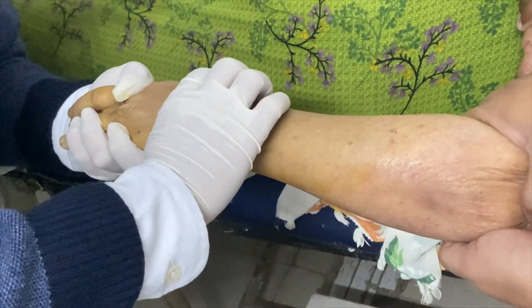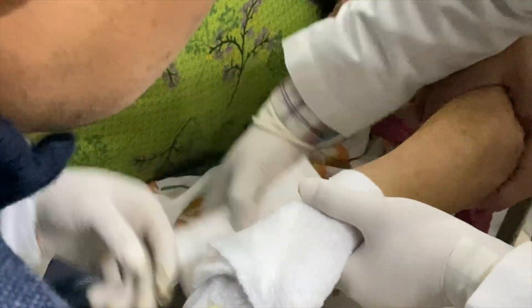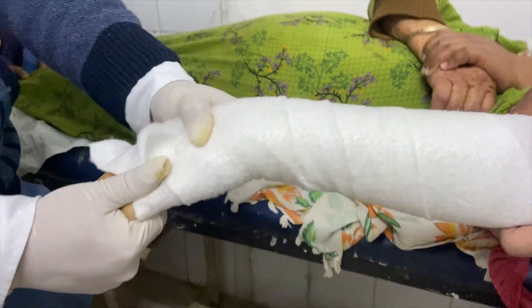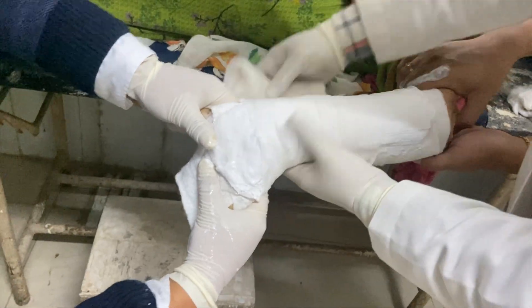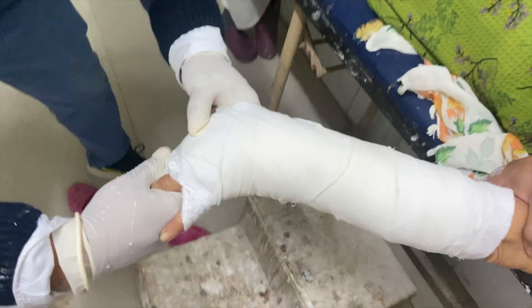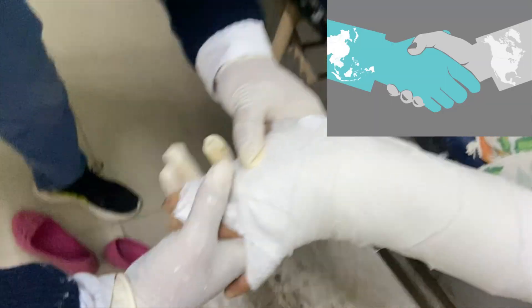Following the whole procedure, there should be constant maintenance of traction. After I am happy with my manipulation, I have to lock the fracture — elbow in flexion, forearm in pronation, wrist in slight volar flexion and ulnar deviation. It resembles a handshaking position.